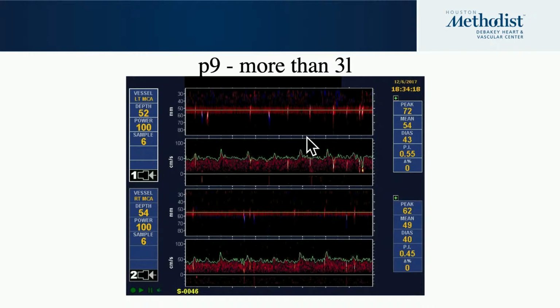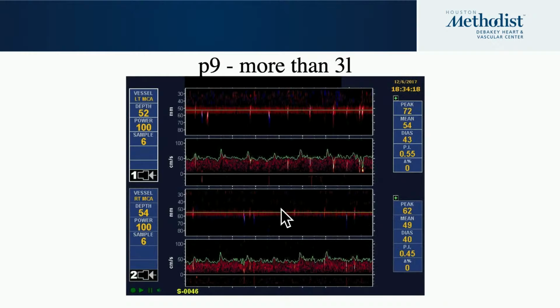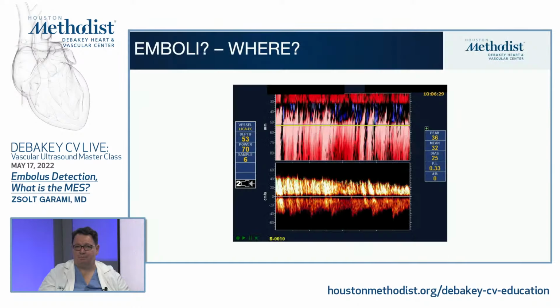So almost like in the ICU, you want to see the threshold, trying to find the best blood pressure and titrate that blood pressure. But in the meantime, you also want to monitor them, because it looks like above P7, you're risking multiple embolization. And again, if this is an 8-second screen, you see multiple emboli on both hemispheres. You're definitely trashing those capillary systems.